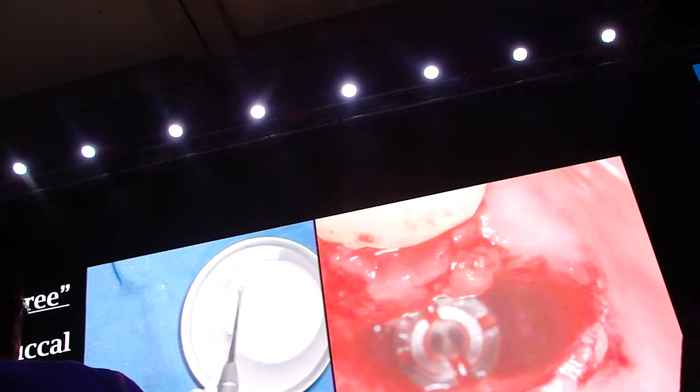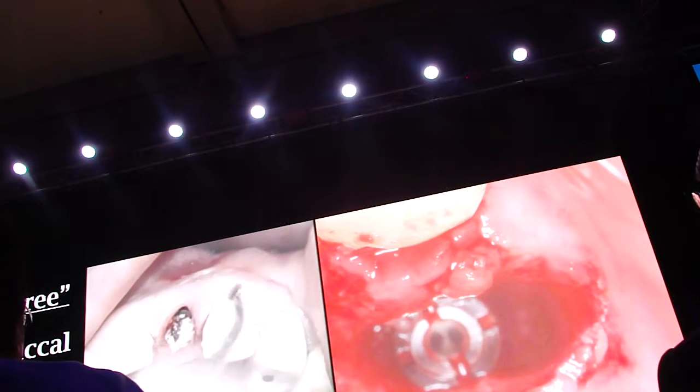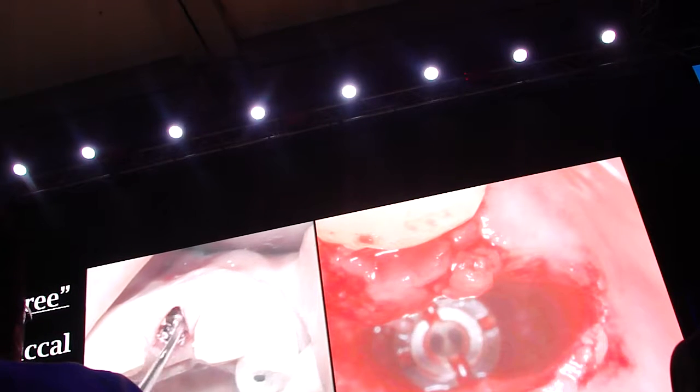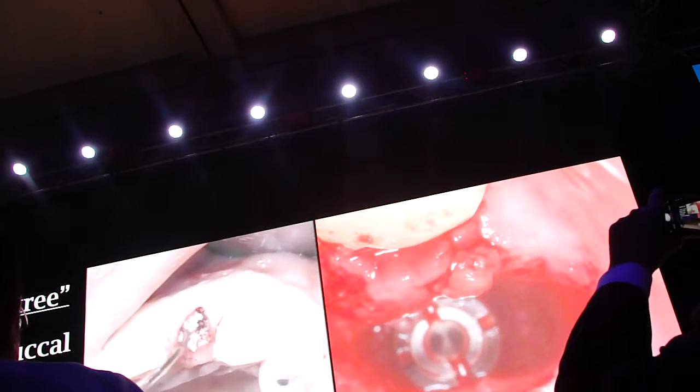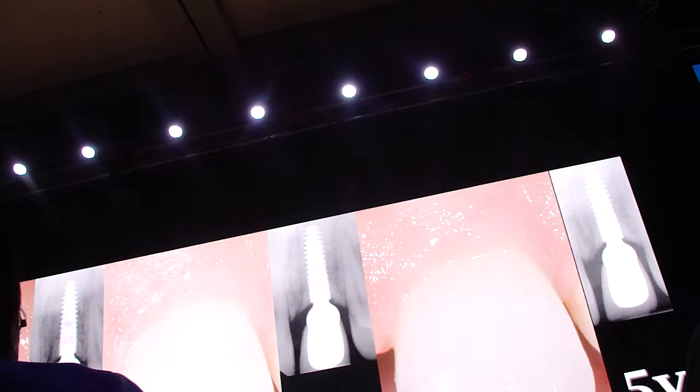So the decision tree I was asked to give by Paul is very clear, in my opinion. Create a buccal gap, which you will have because you place a small implant diameter, and fill it with a stable bone graft. If you don't have bone on the buccal side, don't rely on having tissue. What do we want with this game? If it's only filling a gap which keeps the soft tissue up, wouldn't that be great for our patients? We place the implant, we put some graft in the gap, and that's it? What we need to keep up the soft tissues? Much better than doing connective tissue grafts and taking schnitzel from the palate and boosting the biotype in each and every patient, which you hear also from many lecturers nowadays.